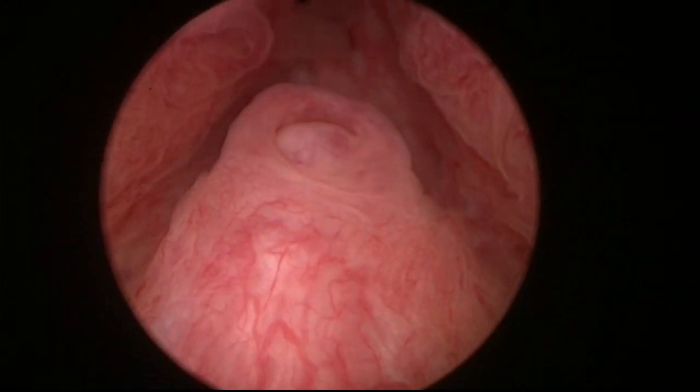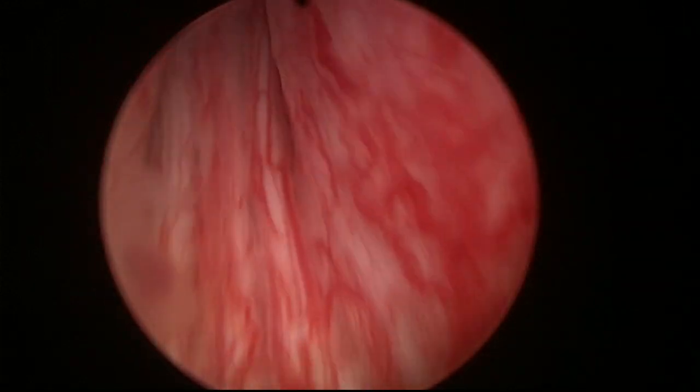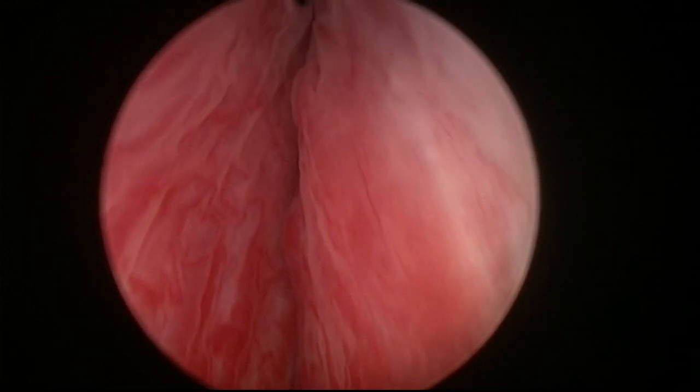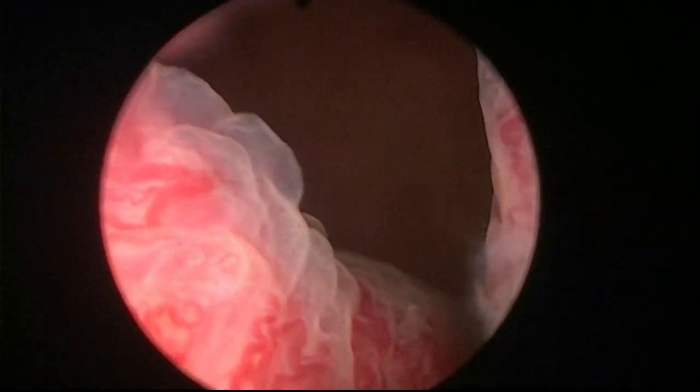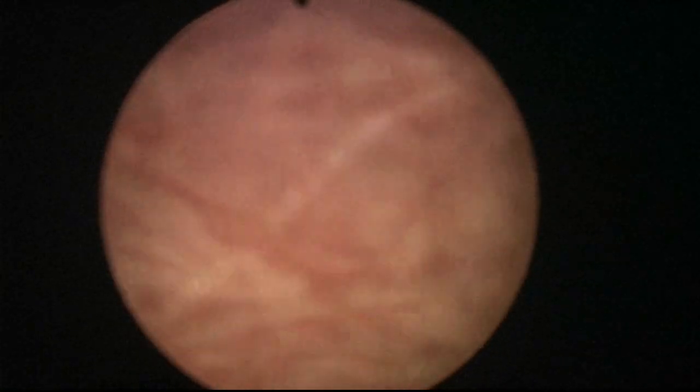We can recognize the verum montanum and we can recognize the edge of the sphincter here. This is not a specially large gland — it is a little bit enlarged but not too enlarged. The ureteral orifices are relatively close to the bladder neck. There's a trabeculated bladder. This is edema from the catheter, and I am going to introduce the laser fiber. I am going to work with a holmium laser.